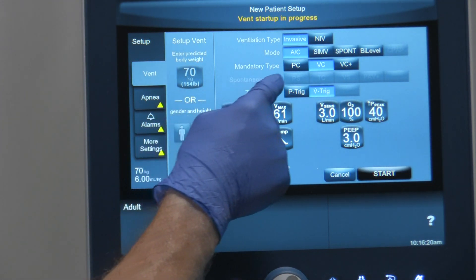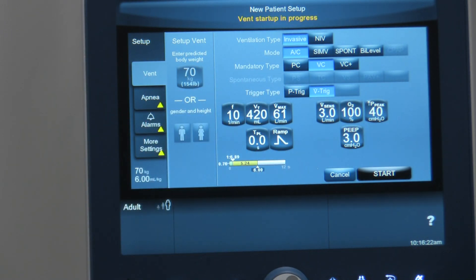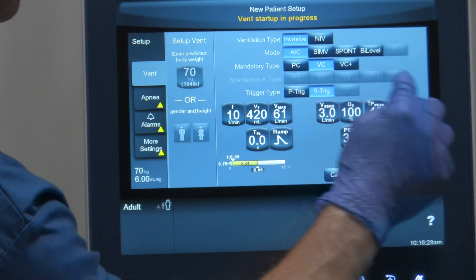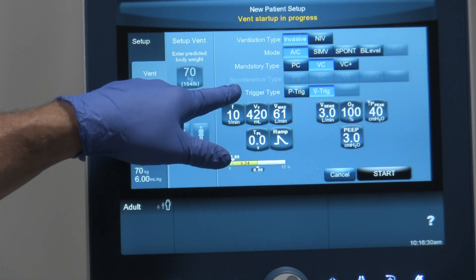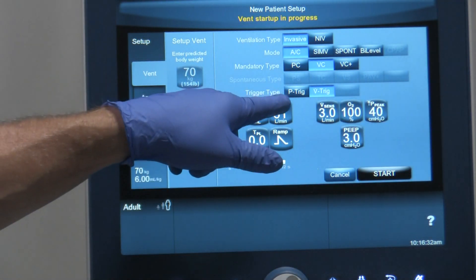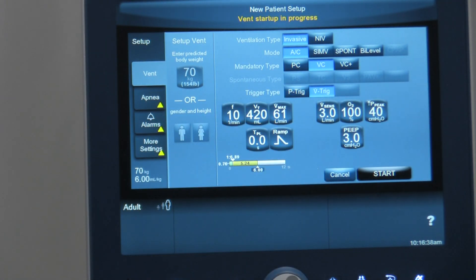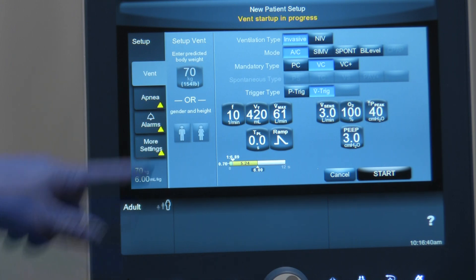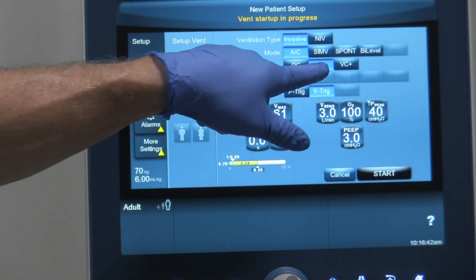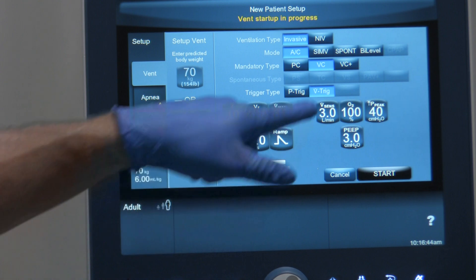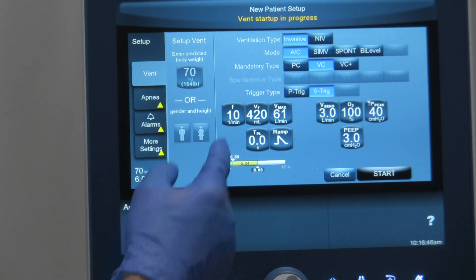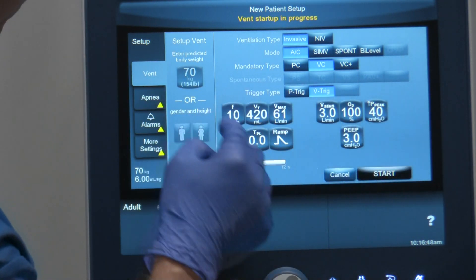Next it has the spontaneous type. Since we're not in a mode that allows spontaneous breaths, nothing there is activated. The next selection is the trigger type — you can choose between flow triggering, which is the default, or pressure triggering. So we'll leave it on flow triggering. Because we chose invasive assist control, a volume-style breath with flow triggering, these are the settings that come up.